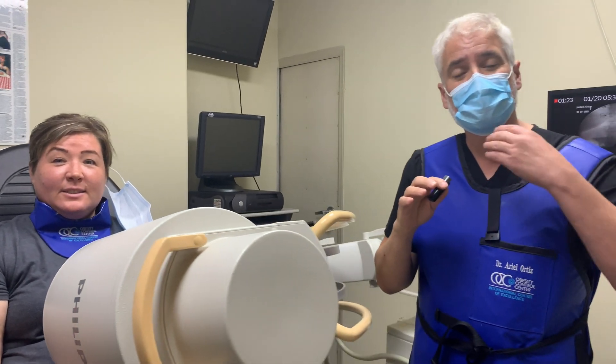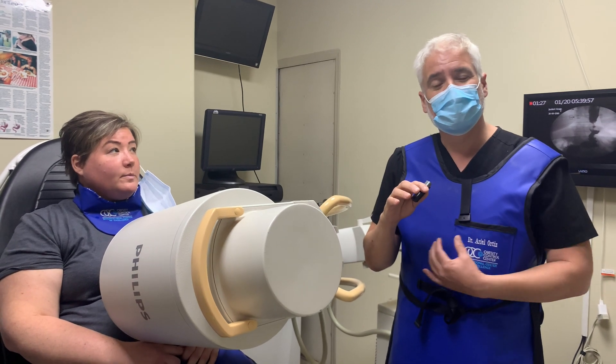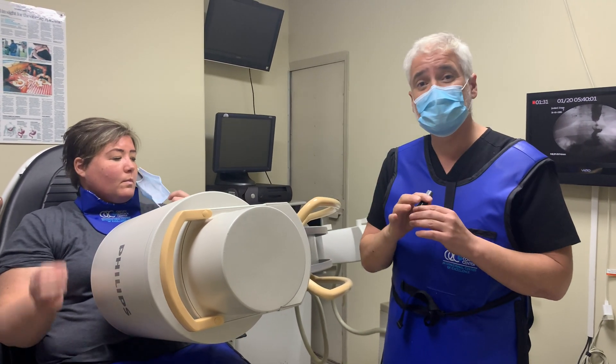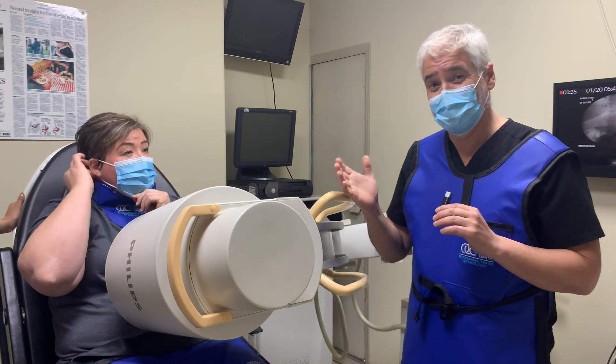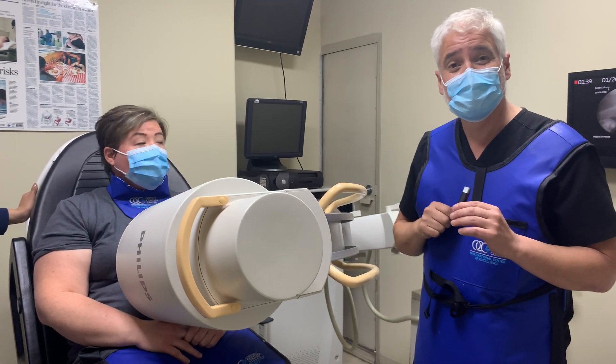That's what a barium swallow is — it shows us the upper anatomy of the esophagus, the lower anatomy of the stomach, and then the intestines. This is the sure way to see what the new stomach size is all about. And it took us literally two minutes.